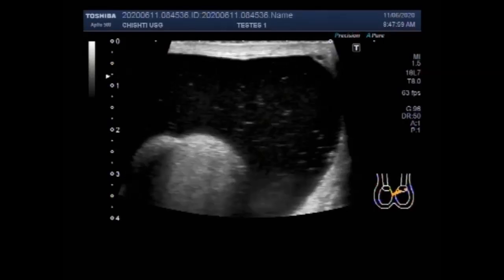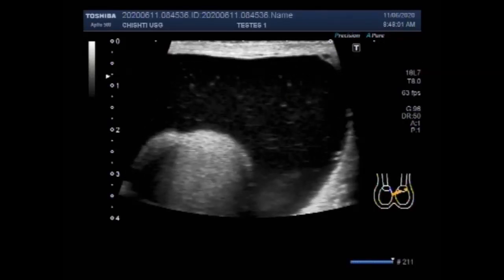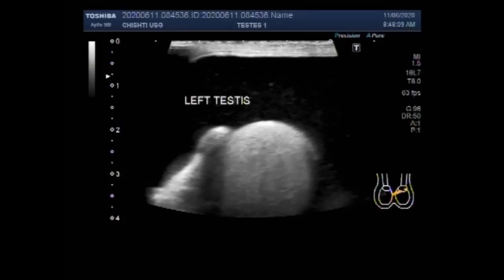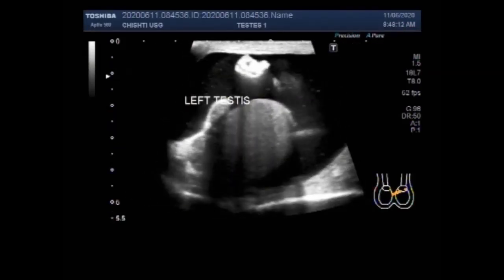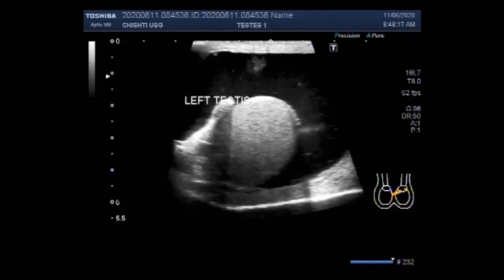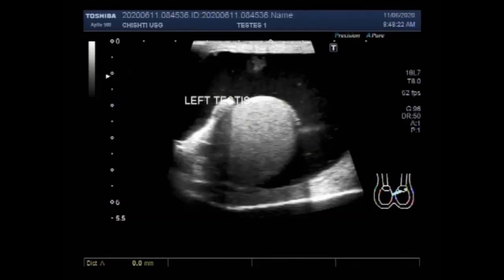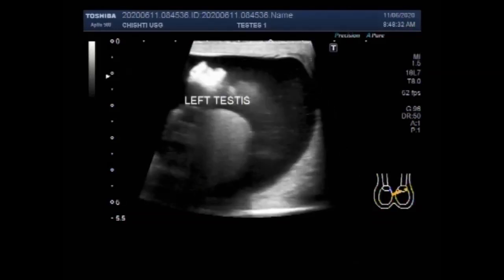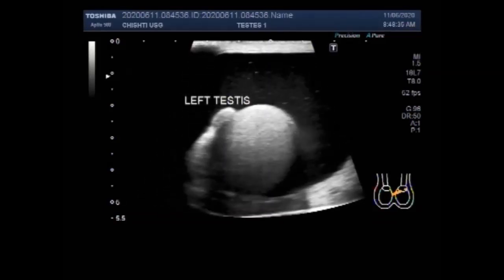Now you are going to see the left testicle and it shows a large piocele. You can see a significant amount of thick sludge and debris in the fluid present around the testicle. This testicle measures about 28.9 x 26.2 mm, which is normal.